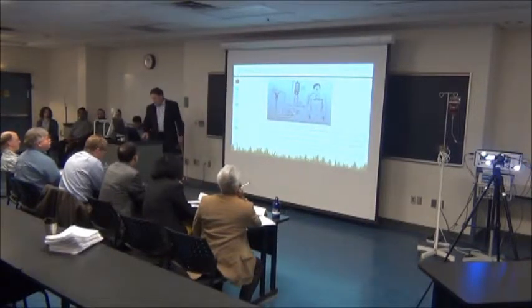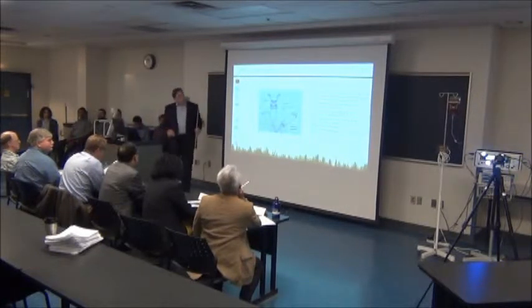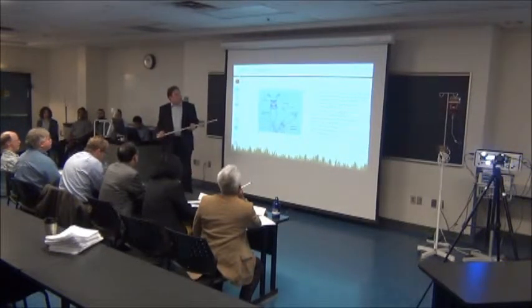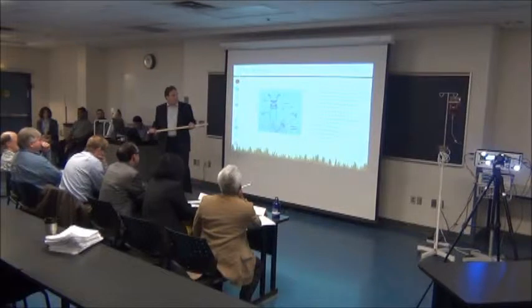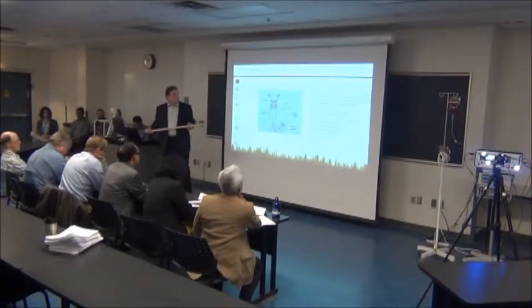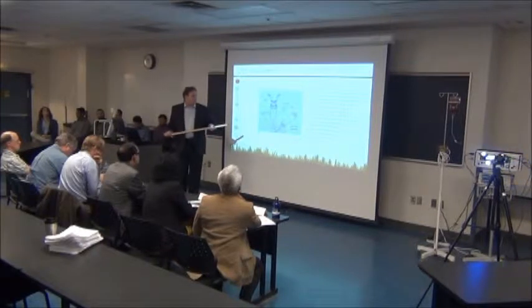The transducer. So the transducer's pressure dome is filled with a saline solution connected to the tubing that is carrying the pressure wave from the heart. The diaphragm of the transducer acts like a microphone, converting the pressure wave to a small electrical voltage. As the diaphragm moves, the voltage increases and decreases.